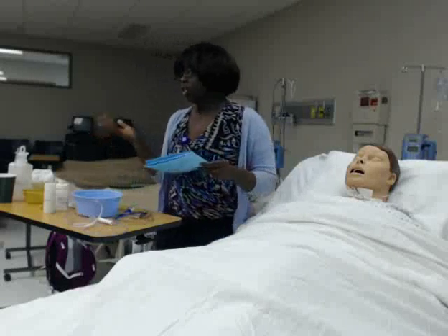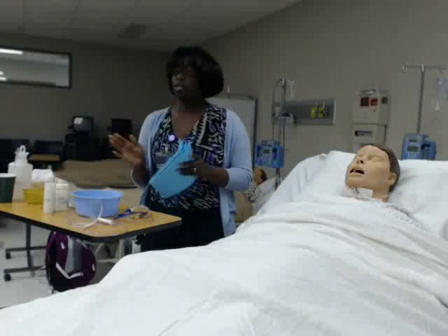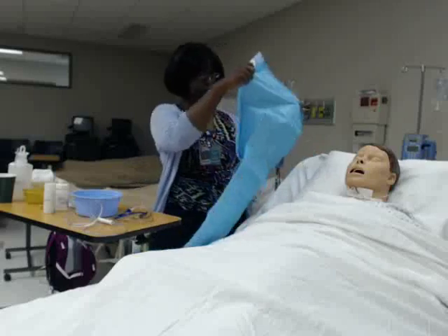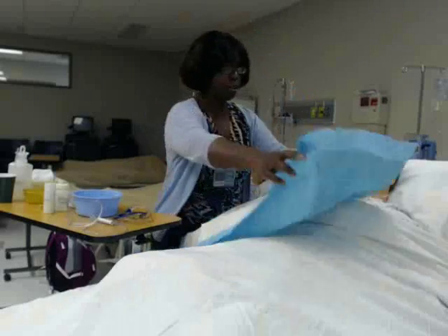So I would have checked my orders, come in, identified my patient, done my hand hygiene, and I'm going to put down this blue chuck for incidentals.